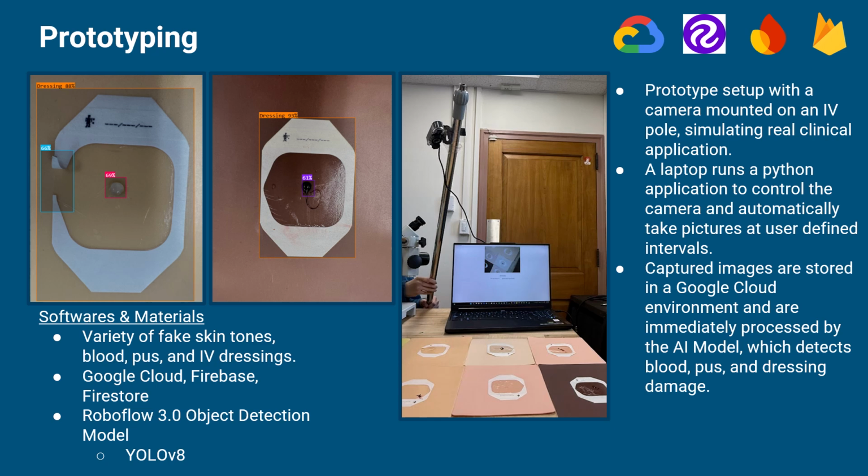Using an open-source RoboFlow 3.0 model, which utilizes YOLO v8 for its underlying architecture, our model accurately identifies precursors to CLABSI with an 88.6% precision, a 92.8% recall, and a 93.0% mean average precision.